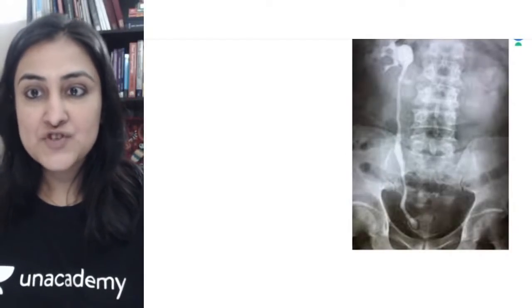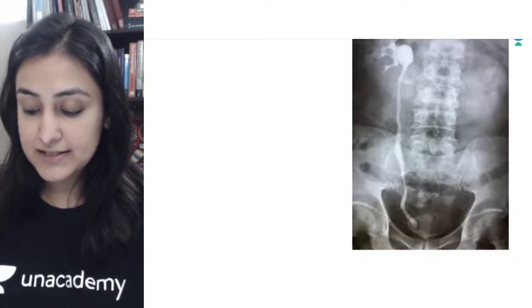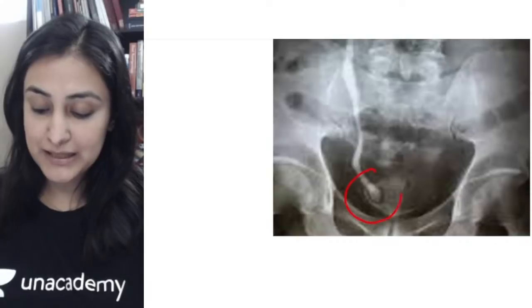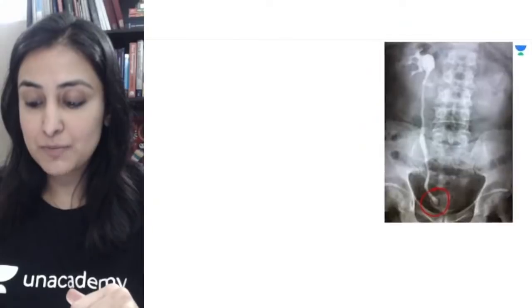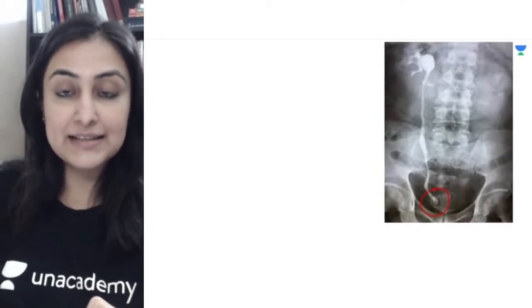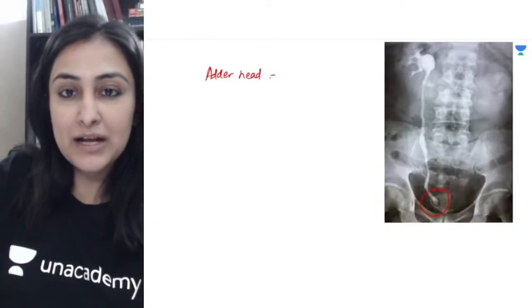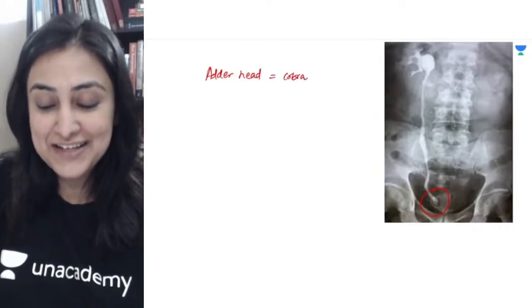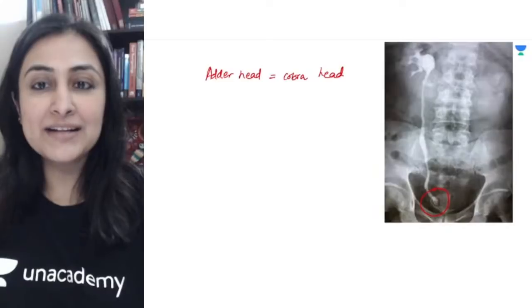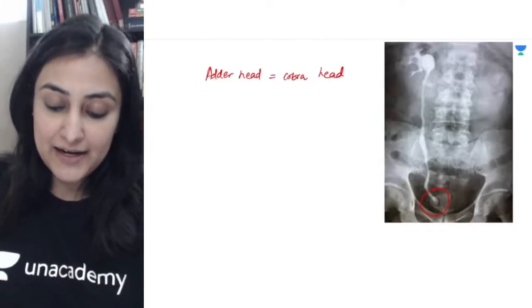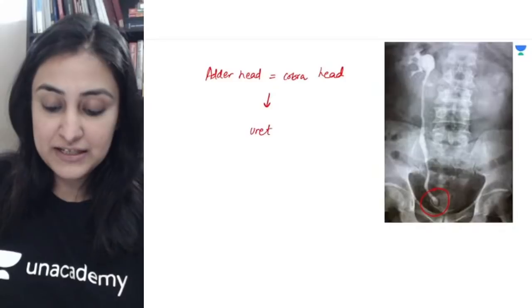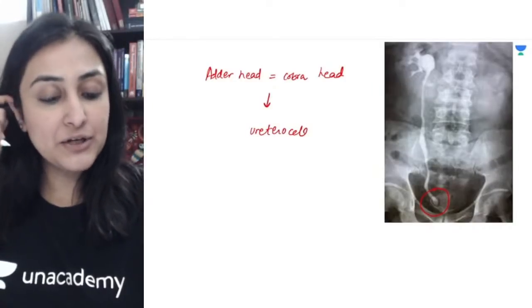Here we can see the abdominal x-ray — you can see the kidney on the right side which is excreting the contrast. At the distal-most end, your focus and attention should be here. I am seeing a cystic dilatation — there's a dilatation of the distal-most part of the ureter. This is the adder head appearance, also called cobra head appearance.